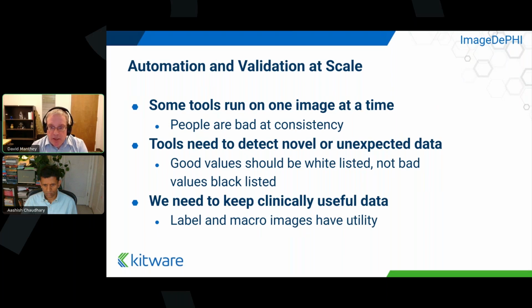You know, we expect a number to be in that field. And if we read that field from an image and it had a text value, we might say that's surprising. Now, it might be that someone has just written out 0.5 microns per pixel and added the text there, but it might be that there's something odd going on. And so this is where our tools are designed to validate these values. So this value must be a number, or this value must be a date, and therefore I know how to deal with it. If not, stop.